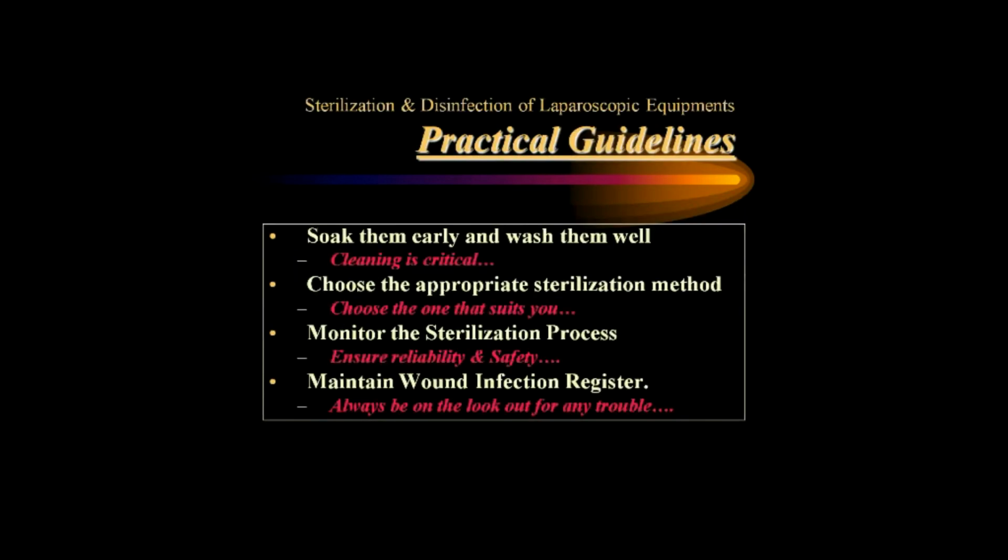So ladies and gentlemen, we should have some practical guidelines, namely we should soak all the laparoscopic equipment early and wash them well. Cleaning is critical. We should choose the appropriate sterilization methodology, choose the one that suits you, and we should monitor the sterilization process to ensure reliability and safety, and we should always maintain a wound infection register so that we should always look out for any trouble. Thank you.